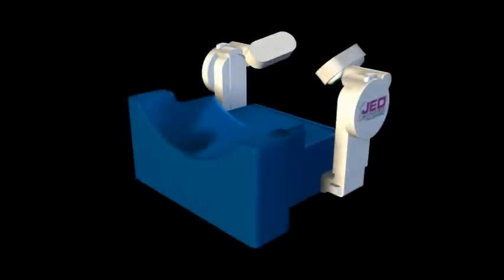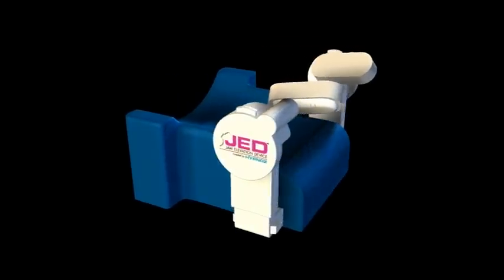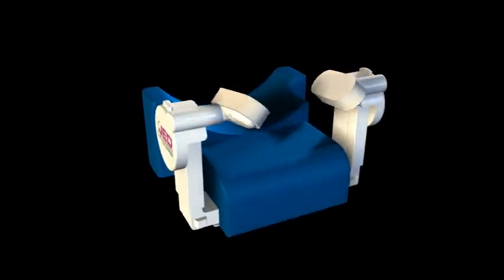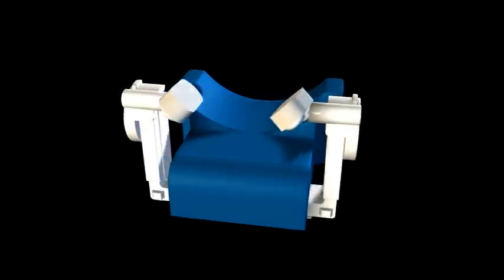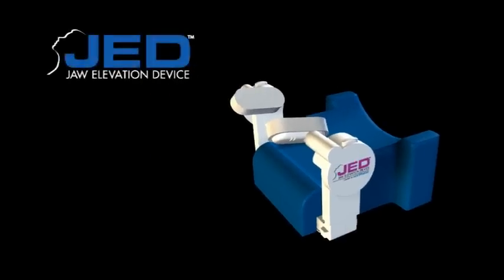The JED can be used in a variety of applications where a patient has an open airway and the potential to obstruct during a procedure. The JED creates the ideal solution for hands-free airway management. The JED — Jaw Elevation Device.